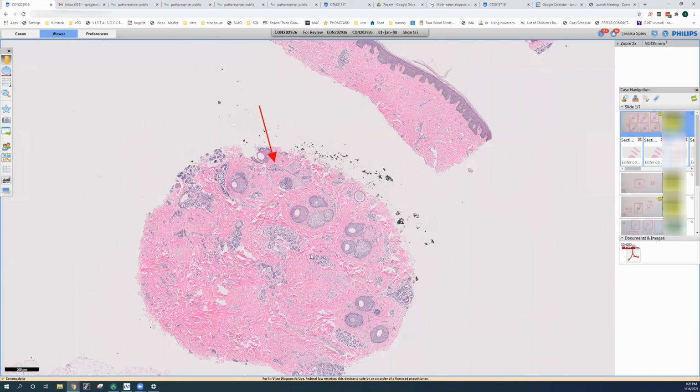The tip to distinguish between the two is that in subacute alopecia areata, you will have dramatic follicular miniaturization along with the catagen telogen shift, and you don't see that in syphilis. Clinically, as I said, syphilitic alopecia can be patchy like alopecia areata, but you won't see the exclamation point hairs of alopecia areata in syphilis.